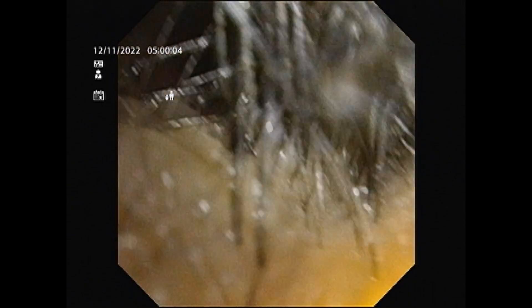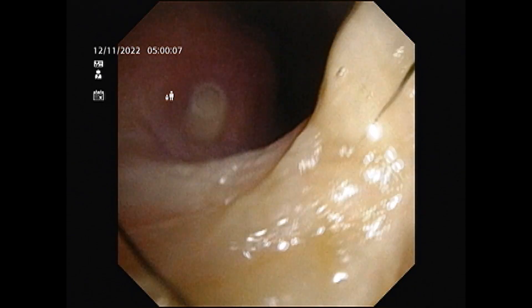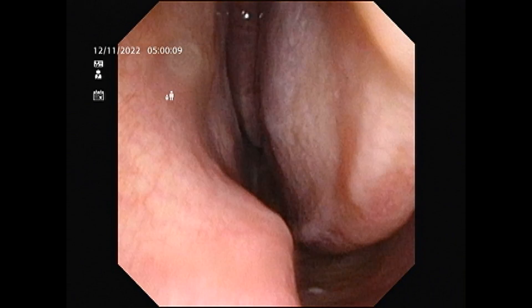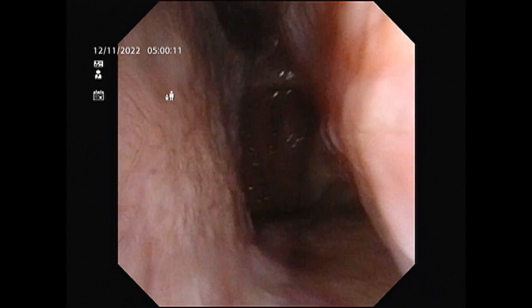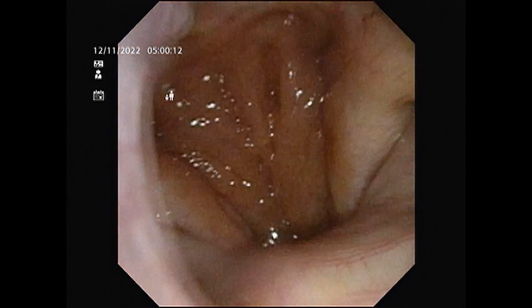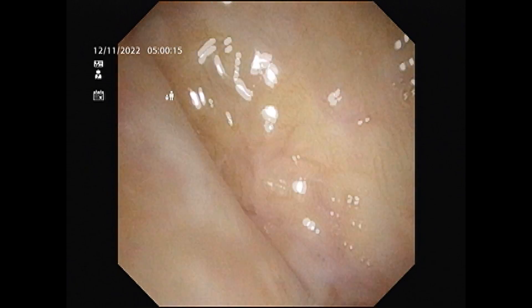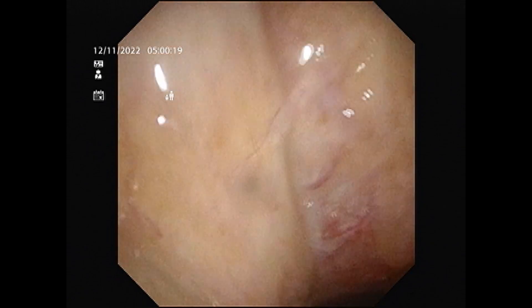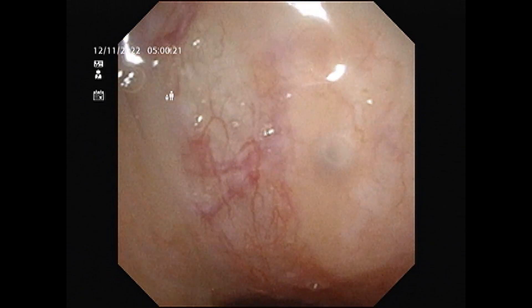That short clip was showing how the patient was snoring under the effect of deep anesthesia. Now, what you are seeing right now is the patient's left cavity of the nose. I am going through that cavity into the oral cavity from the nose — entering the patient's mouth from the patient's left side nose.